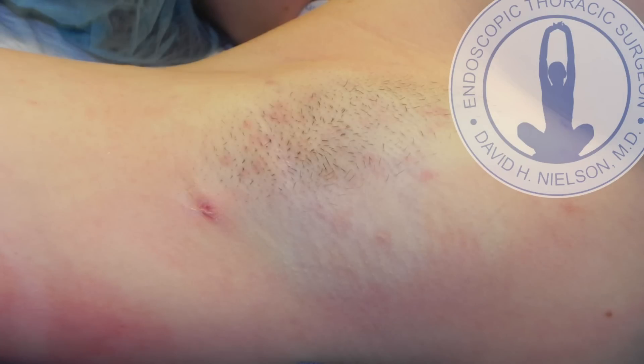This is what it looked like at the end of the procedure, and you can see the sweating — which for her was severe — has completely stopped. Here's a picture of the right underarm the following morning after having had the SDLA procedure done on both underarms. She had gone out the night of the procedure, and for the first time she hadn't been dripping sweat and soaking through her clothing from the underarms, for as long as she can remember.